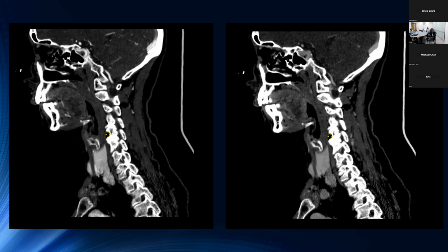where you'll have either hyperattenuation of the parathyroid relative to the thyroid with subsequent washout, or isoattenuation, as in this case, with that washout. Even on the non-contrast images, you typically do get some difference in the attenuation of these, and it allows us to improve our diagnostic accuracy, allows us to differentiate these lesions from either exophytic thyroid lesions or lymph nodes.